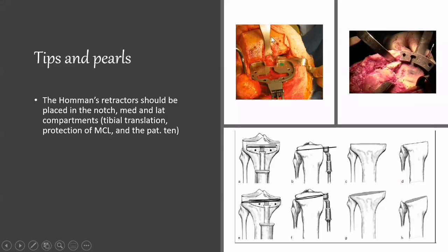Some of the surgeons prefer it from the lateral, as you see in this picture. This is the lateral and this is the medial, sorry. So you don't have to go medially more. Be aware of that. Also, don't forget your 2 Hohmann retractors for the MCL and the LCL and patellar tendon. And here is what we saw in the picture before, how the cut is most perpendicular, and this is the cut when you go for more valgus.